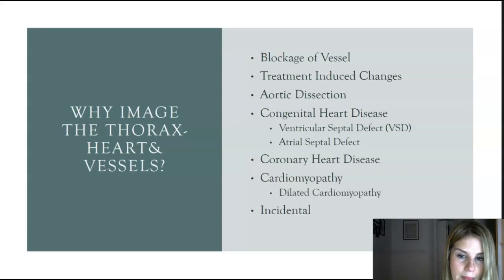Other reasons why you might image the heart is if there's any suspicion of coronary heart disease, which is just stenosis, so a blockage of the blood supply going through the coronaries, which are the arteries that actually provide the heart with blood. Or you could be concerned about cardiomyopathy. So there's lots of different things that you'll be referred for imaging of the heart for. And sometimes that's not the reason why you've been sent for a scan. It might be that they find something incidental when they're doing a cardiac CT or a thorax CT for another reason, and then they see something on the heart.